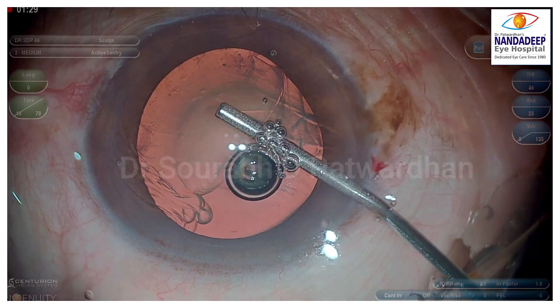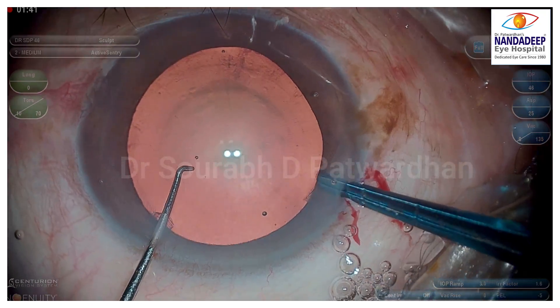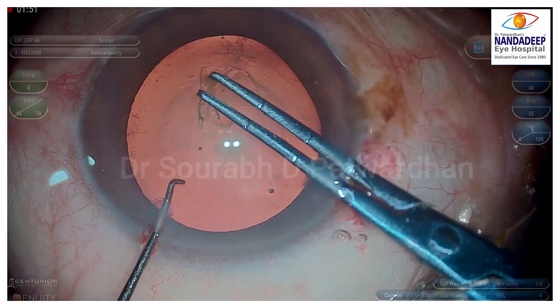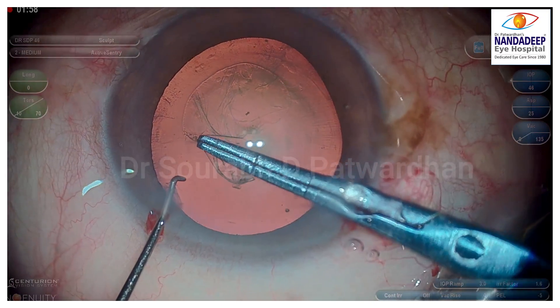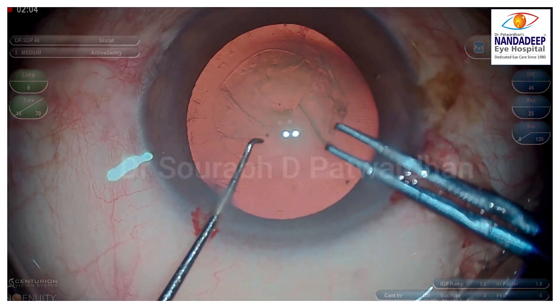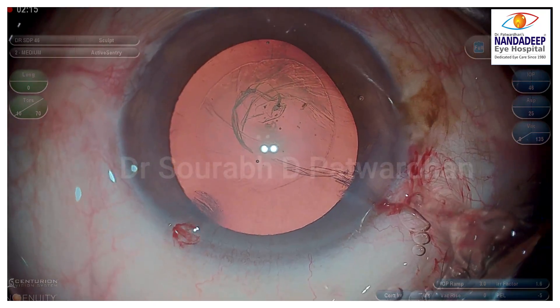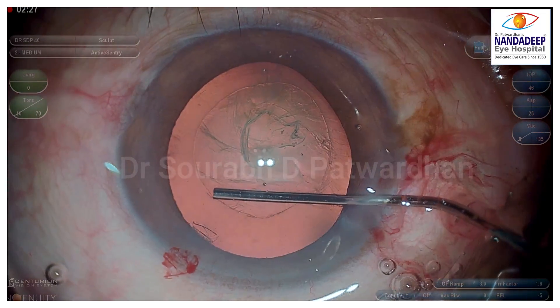Surgically, it doesn't make much of a difference if you are using forceps to make the capsulotomy. You just need to be careful not to go too much into the periphery. With cystitomes, sometimes there is a problem because of zonular attachments and you need to use more force. I would always prefer forceps in these cases for better control. The anteriorly placed zonules are getting broken, but the other zonules are intact, so there's no issue with the stability of the bag.